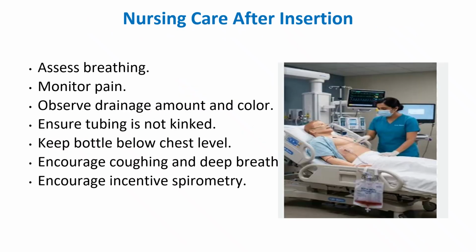So, nursing care after insertion. After the ICD is done, what is the aftercare? You have to assess the breathing pattern. You have to check the pain level of the patient. Observe the drain amount and color. What kind of drainage has been aspirated, either bloody, or pus collection, or excessive fluid collection. So you have to assess the drainage amount and ensure the tube is not kinked. And a very important point is to keep the bottle below the chest level.